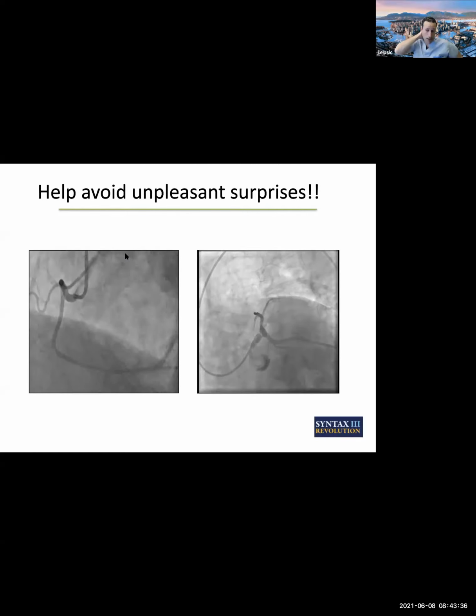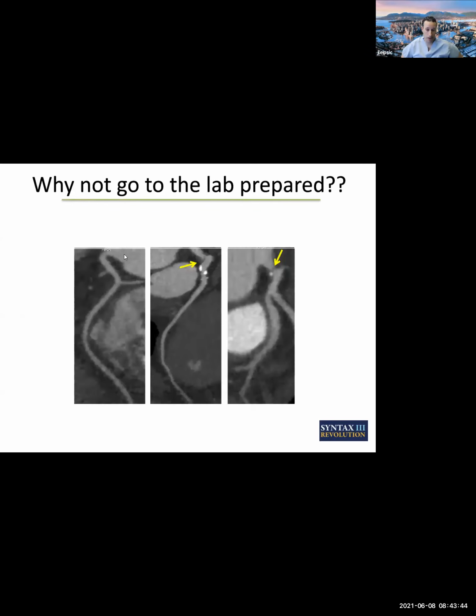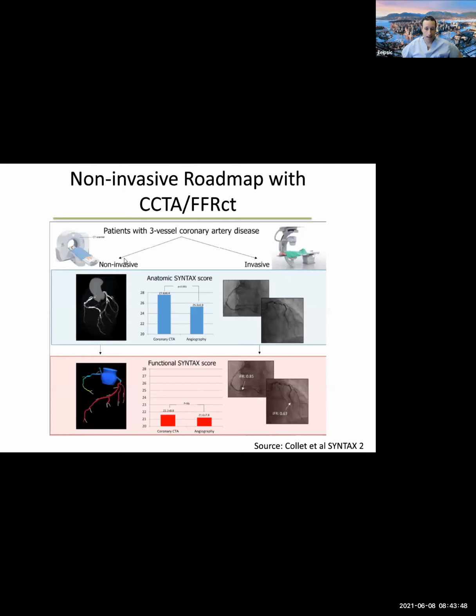I would also posit to you that the days of going to the cath lab and having unpleasant surprises of critical left main could be behind us, that we could be diagnosing these critical left main lesions on CT. And finally, what are the opportunities of anatomy and physiology?